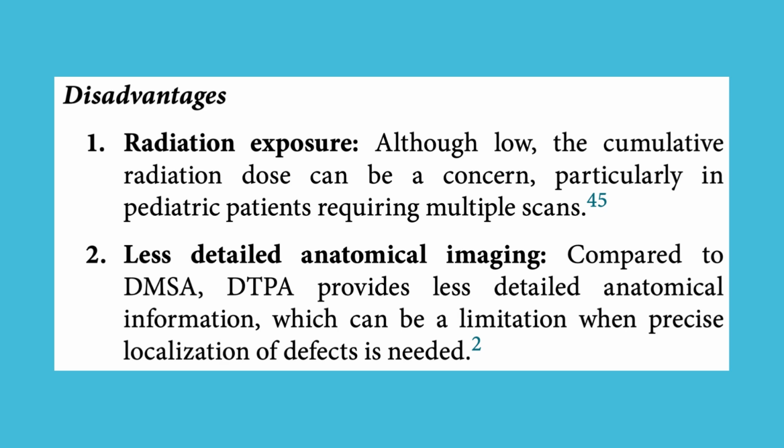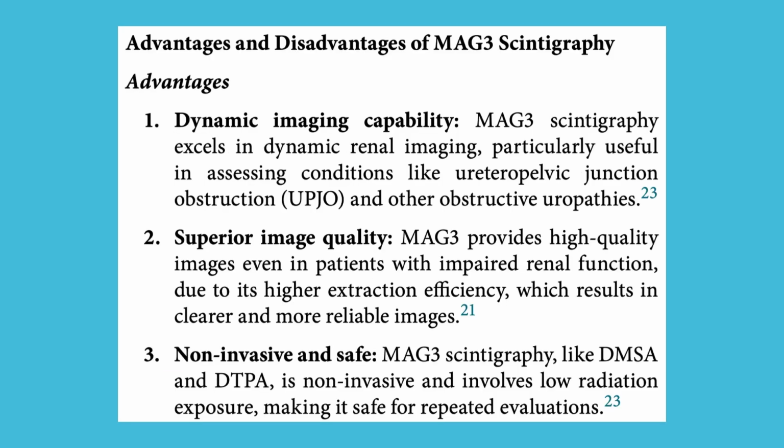Although low, the cumulative radiation dose can be a concern, particularly in pediatric patients requiring multiple scans. 2. Less detailed anatomical imaging. Compared to DMSA, DTPA provides less detailed anatomical information, which can be a limitation when precise localization of defects is needed. Advantages and disadvantages of MAG3 scintigraphy.